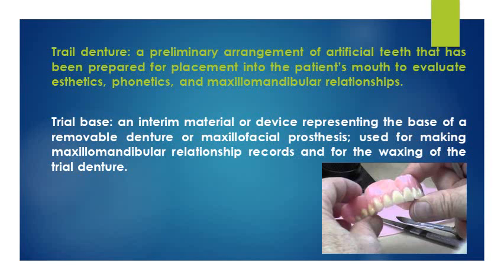At first, we define the trial denture: a preliminary arrangement of artificial teeth that has been prepared for placement into the patient's mouth to evaluate aesthetics, phonetics, and maxillomandibular relationship. So we need to try the aesthetic and phonetic and the relation between upper and lower denture.